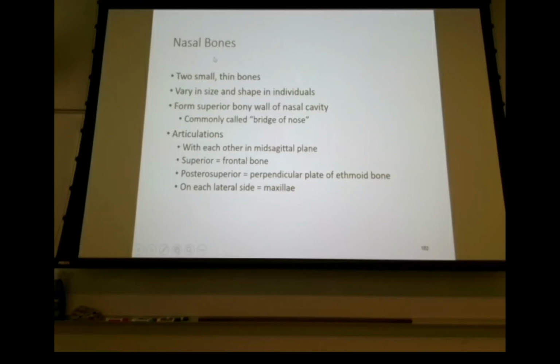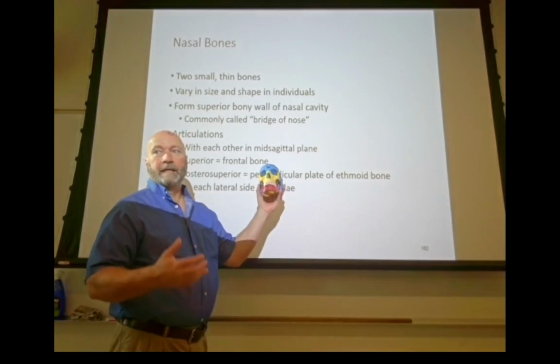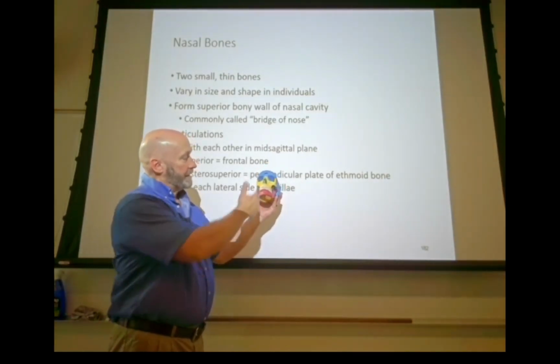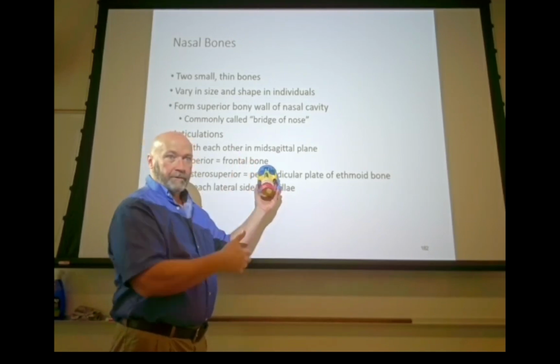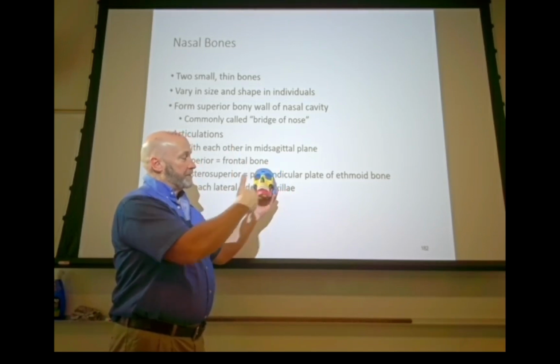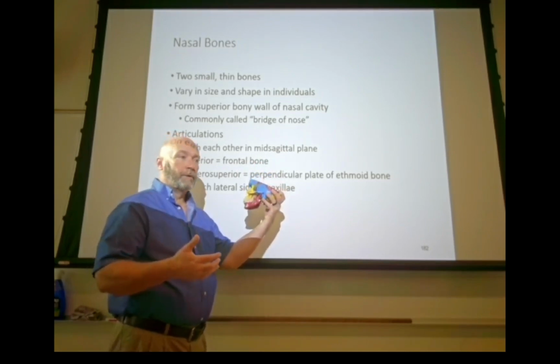Nasal bones are supposedly on a different test. I think there is a question on this test on nasal bones. Our nasal bone series typically consists of a 37 Waters. I'm just showing you this AP so that you can see what happens when we pull the patient's chin back: the nasal septum becomes more vertical. What we're looking for in nasal bones is deviation of the nasal septum on our Waters. So we're going to do a 37 Waters, and then both laterals.